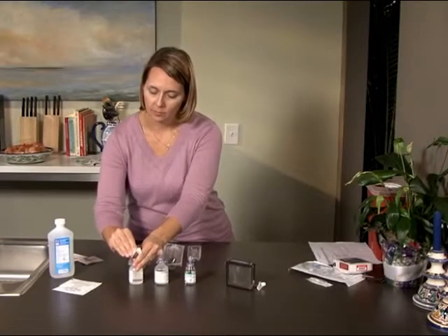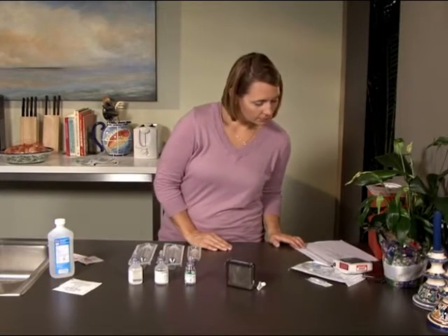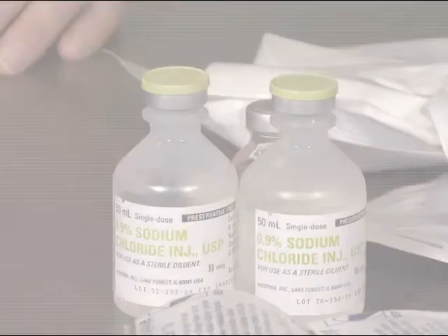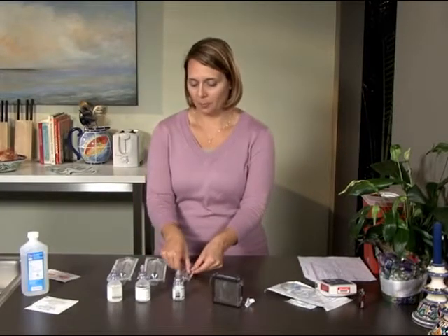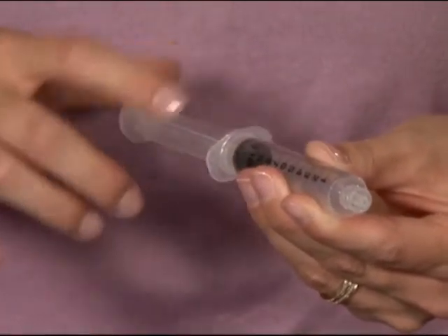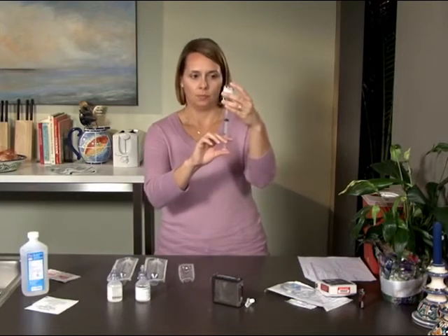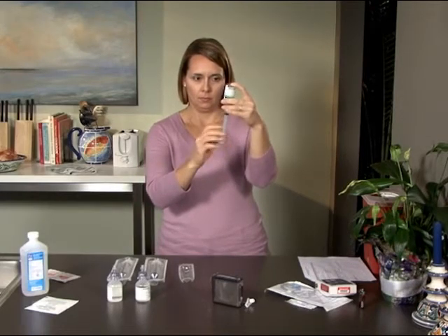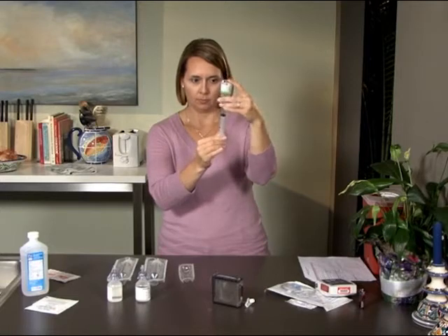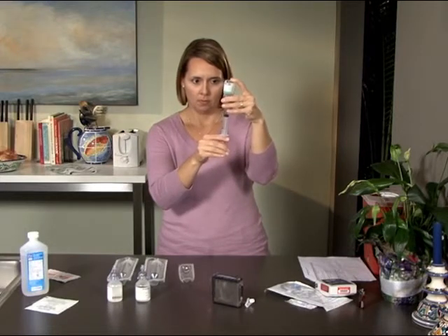Mixing your Remodulin correctly and accurately is extremely important to protect your health and safety. You should always begin the process by checking your dosing sheet and verifying the amounts of Remodulin and sterile diluent you will be placing in the cassette. Once you've verified the correct amounts, take the 3ml syringe and pull the plunger back to the mark corresponding to the amount of Remodulin prescribed on your dosing sheet. Attach the syringe to the vial of Remodulin and push the plunger completely so that all the air in the syringe enters the vial. Invert the vial and pull the plunger back, drawing in the dose prescribed on your dosing sheet. Tap the sides of the syringe to remove all air bubbles and check to make sure that the correct amount of Remodulin is in the syringe.